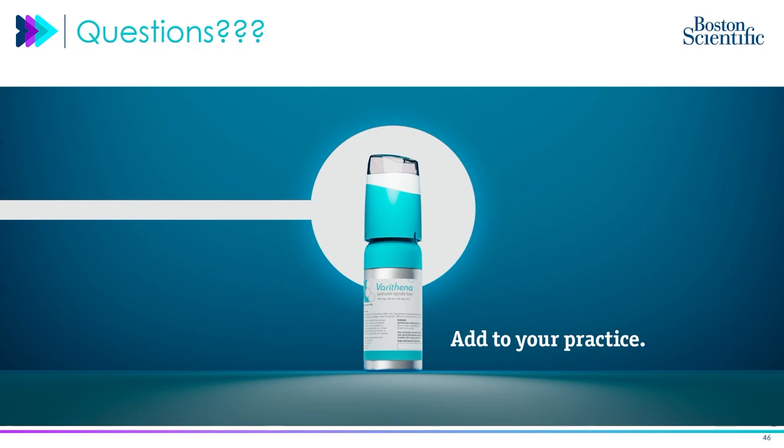But my concern is always DVT, and we take all the precautions that you say, and we have excellent sonographers, and that I think makes a difference on the incidence of DVT. Calf vein is what I'm talking about, in the patients who have multiple perforators and so on. I try to stay away from multiple perforators if they are big, even if it's an ulcer patient. I would treat that perforator first and then treat in C5 and beyond disease. But my concern is DVT, and I try to do everything that the company tells us with the rep, and we have great sonographers. So we find our incidence is still about 3%.